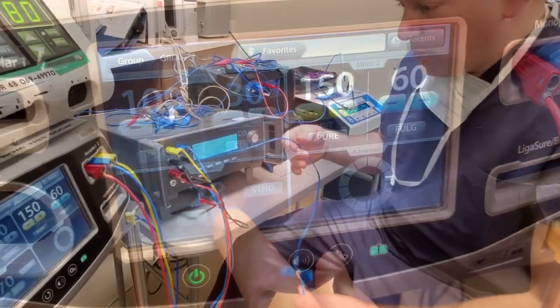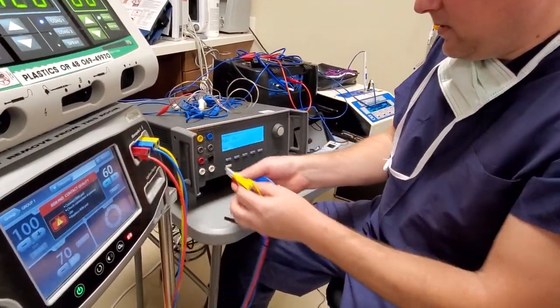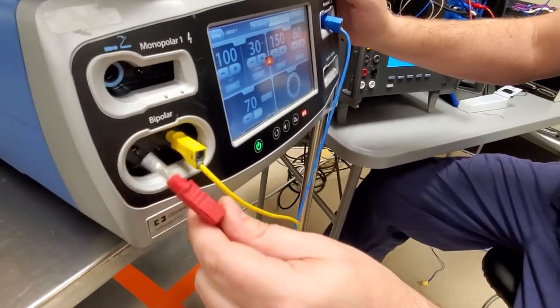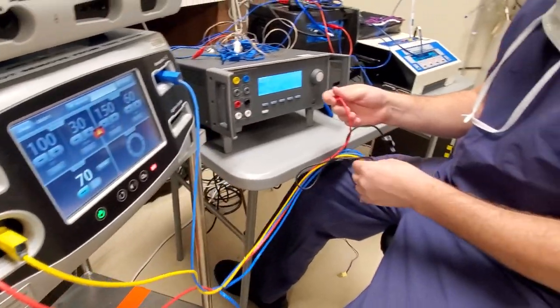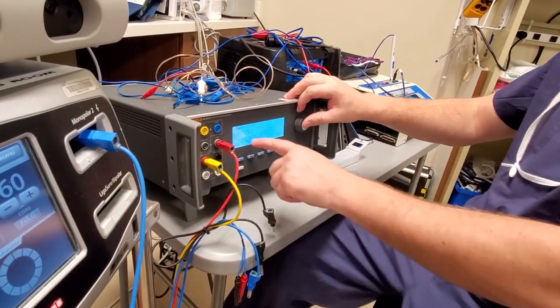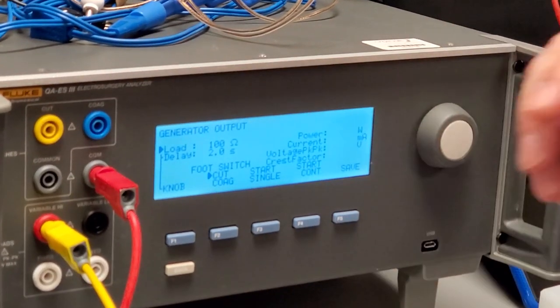We are going to convert this to run bipolar. After testing monopolar 1 and monopolar 2, I disconnect my wires. To test bipolar I need two jumpers — yellow and red. Connect them in, remembering you have to depress the buttons on the front. Take yellow and red over here — plug one into CQM and the other into variable high. In order to test bipolar we have to adjust the load because 300 ohms is for monopolar. For bipolar we are going to 100 ohms — many units use bipolar at 50 ohms, but this one is 100.